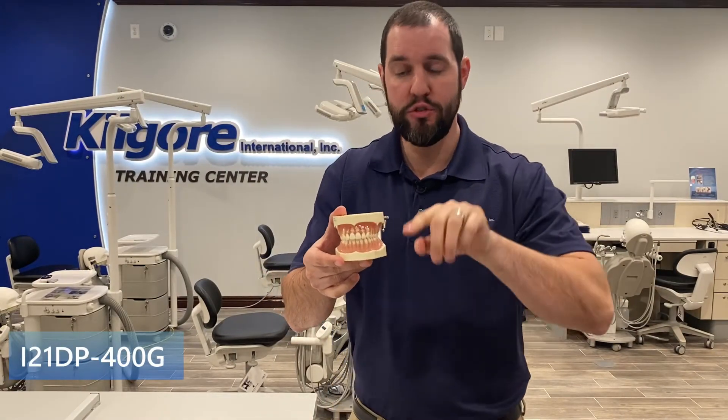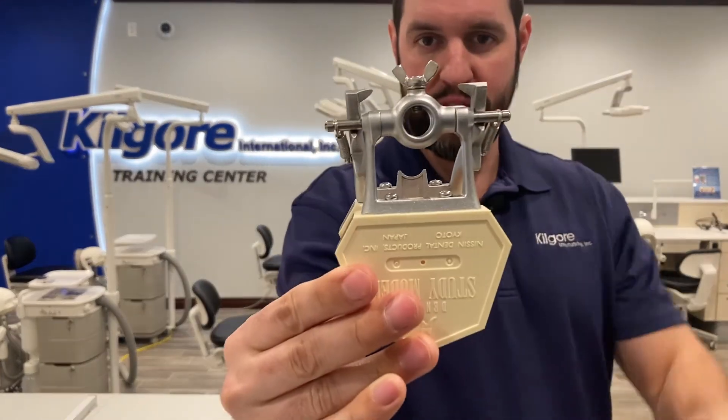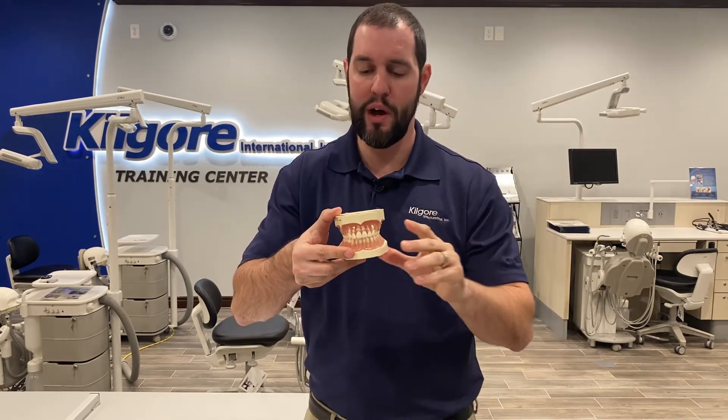These are the I21DP-400G — so again, superior crown and root anatomy, two-tone color to distinguish between the crown and the root, friction-held — everything I just talked about, except you can pull-mount it. You can use the DP articulator to go ahead and pull-mount this if you want. If you want to do instrumentation and things of that nature, you can put a probe in there as well. Sometimes it's easier to have the stability of the pull-mount, and you can do that with the I21DP-400G.